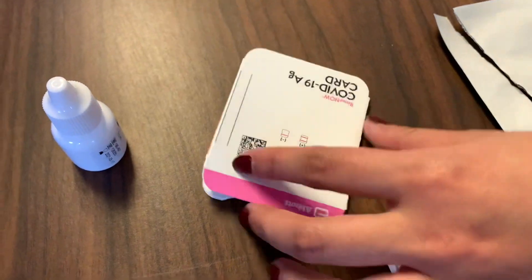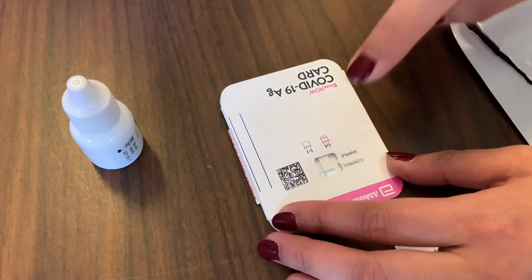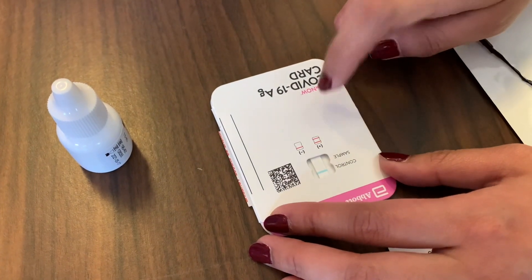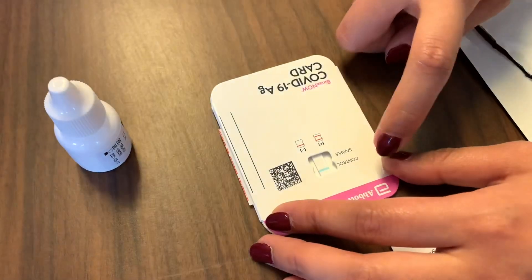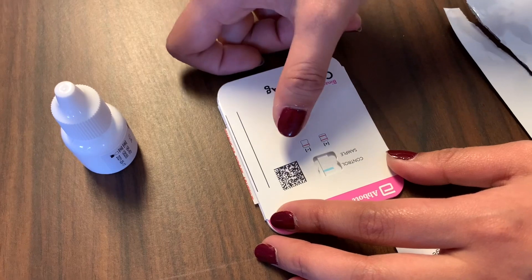What you want to see is for the blue line to go away and to turn red. If it stays blue, it's invalid and you have to do it again. Or if it stays blank, it's also invalid and you have to do it again. There always has to be a red line at the top.